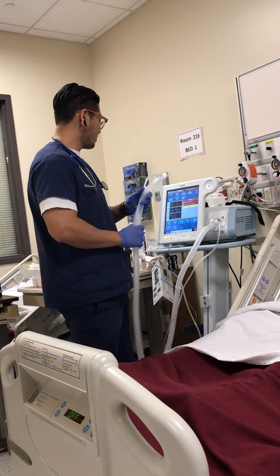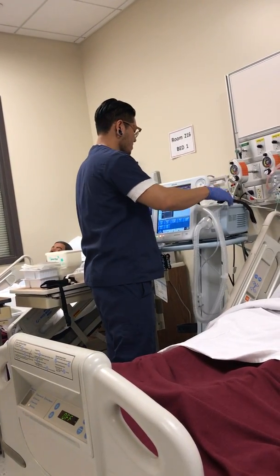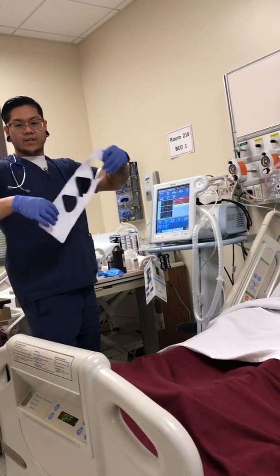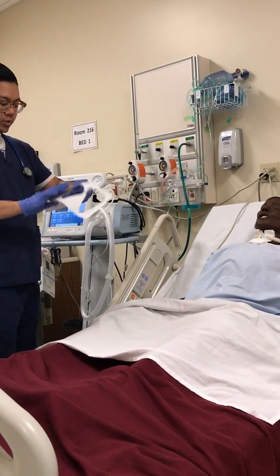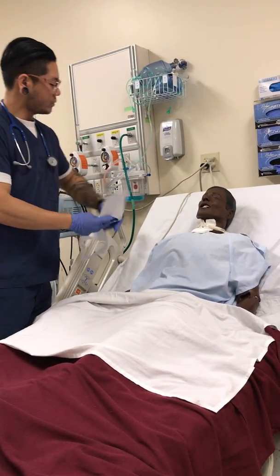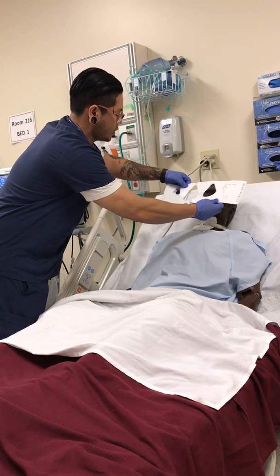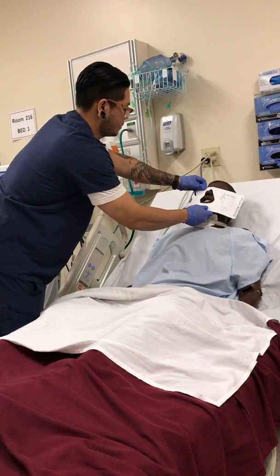Okay. After it's activated, let's start with finding out what size he is. Okay, so usually small works, but you always want to check. When you measure, you want to measure the bridge of the nose to the bottom lip. So you're going to want to check all of them to see if it works or not. Apparently medium doesn't work, so go to small, alright?